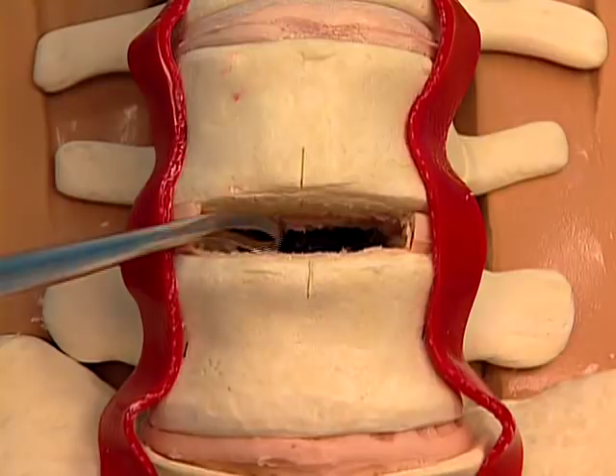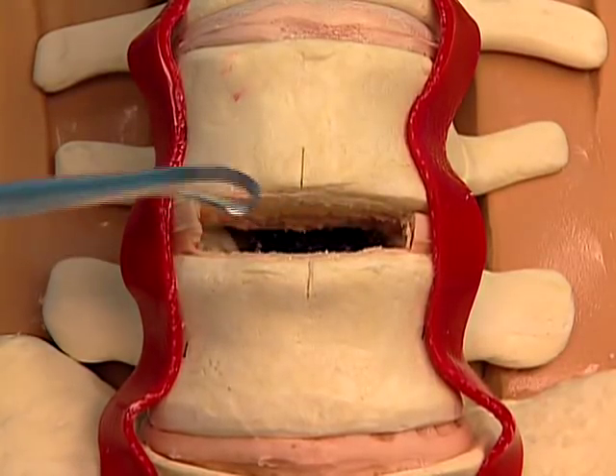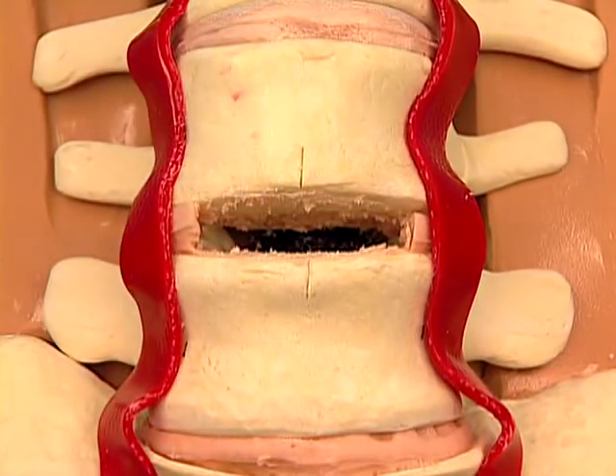Remove the cartilaginous end plates to bleeding bone, taking care to not compromise the integrity of the bony end plates. The posterior annulus should be completely exposed and resected as necessary to expose the posterior longitudinal ligament and to remobilize the segment.